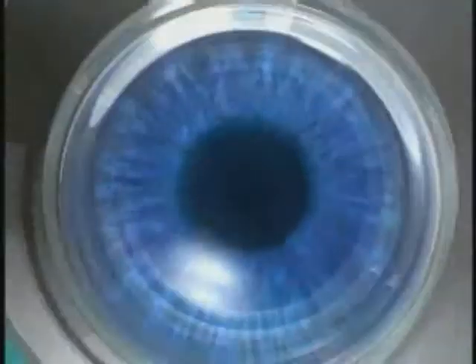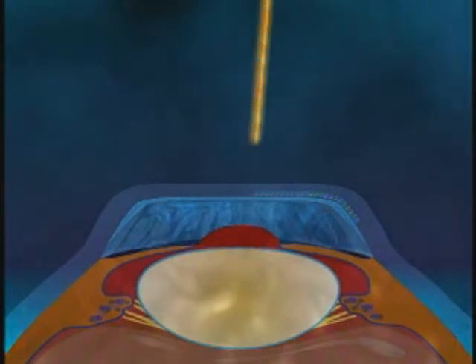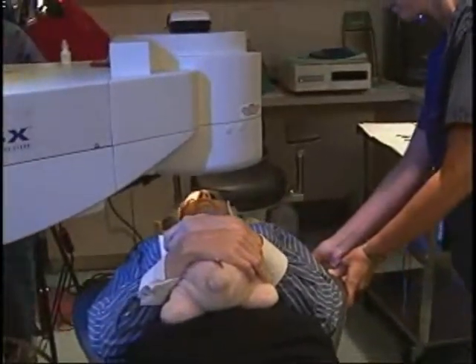There is a mild pressure on the eye, which is somewhat less than that with the suction of the microkeratome. Your vision will still gray out. At the end of the procedure, you are able to blink normally, but your vision will be extremely blurry. We will then escort you out of the Intralase suite and ask you to wait about 10 to 15 minutes prior to performing the laser sculpting portion of your procedure. The remainder of the process is identical to what we have previously described.